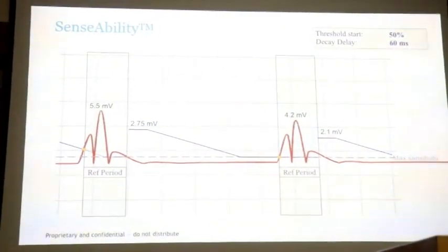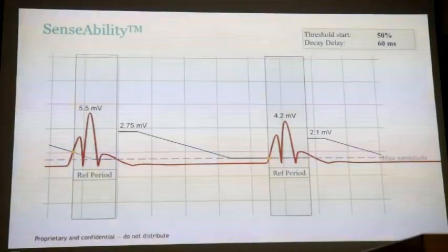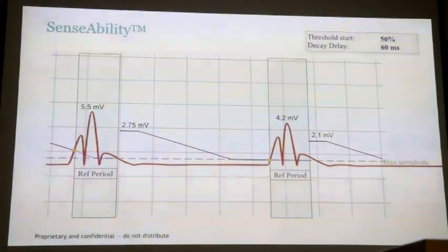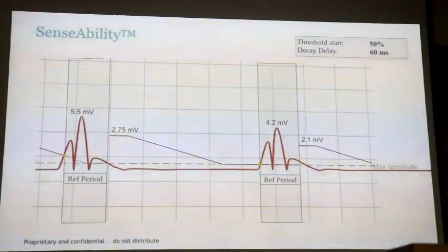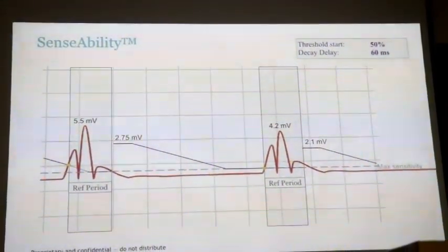There's one specific case I saw where the T-wave was actually of a higher voltage than the R wave. Yeah, that can happen. Was that with an Abbott device? I can't remember the case. Yes, sometimes that can happen, and that's pretty unusual. I've got some cases, and you'll see what happens. But I would suspect that was with an older device, probably some time ago.